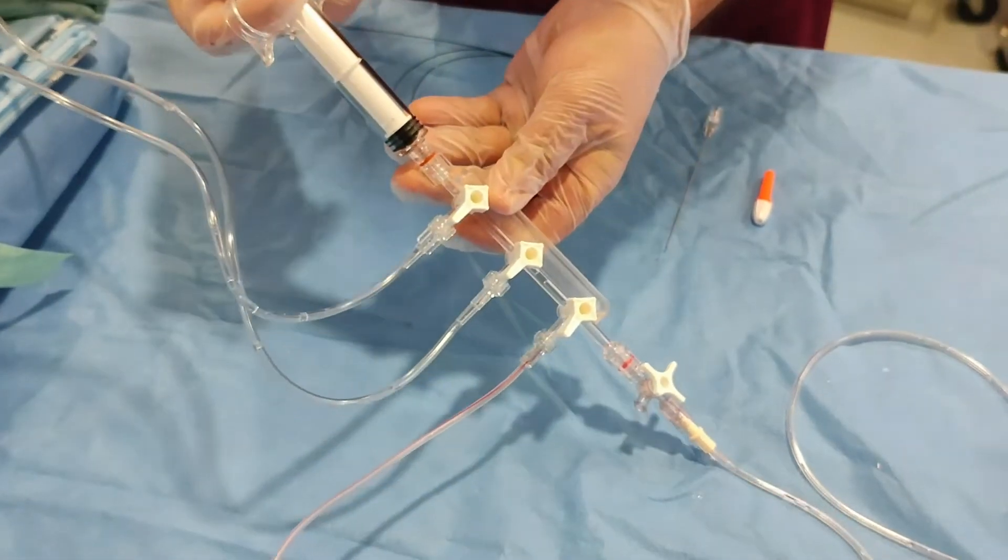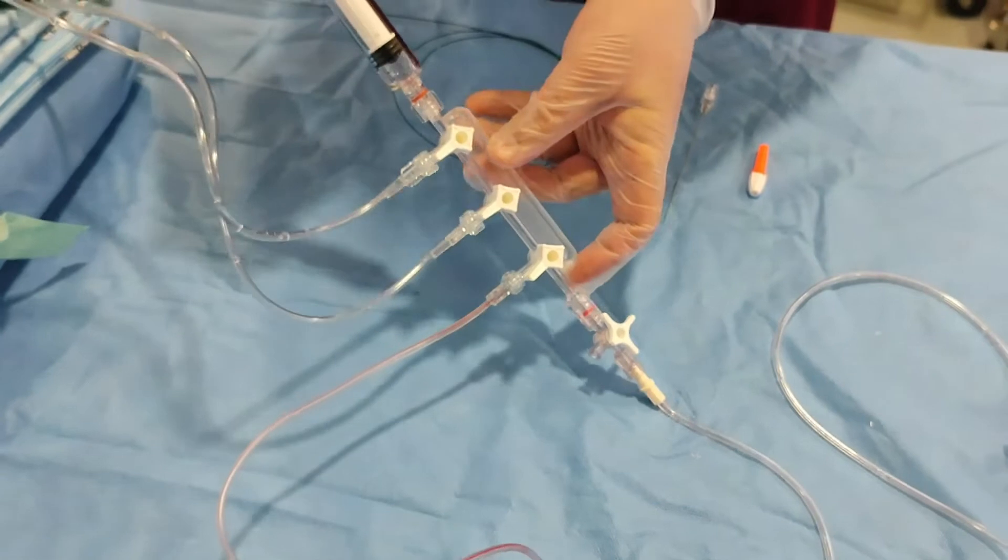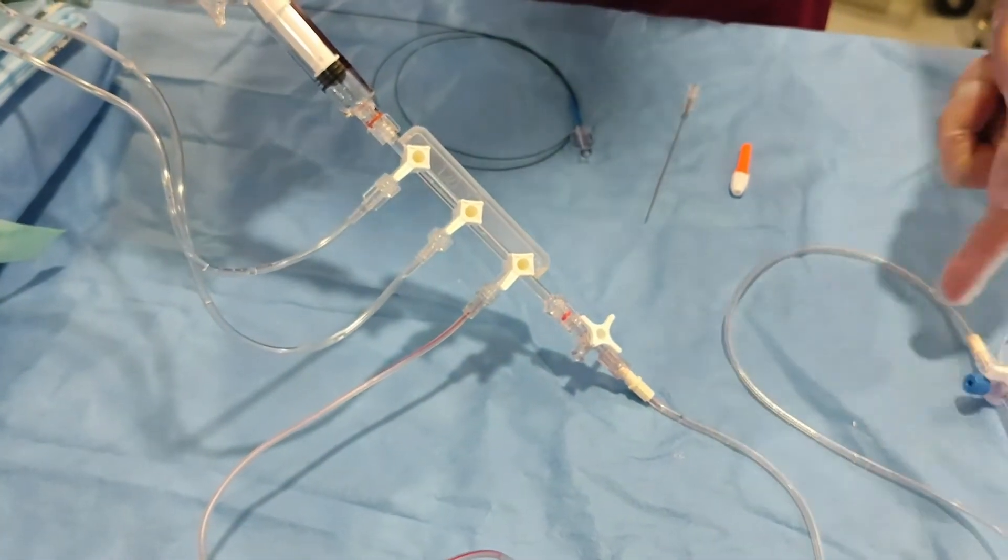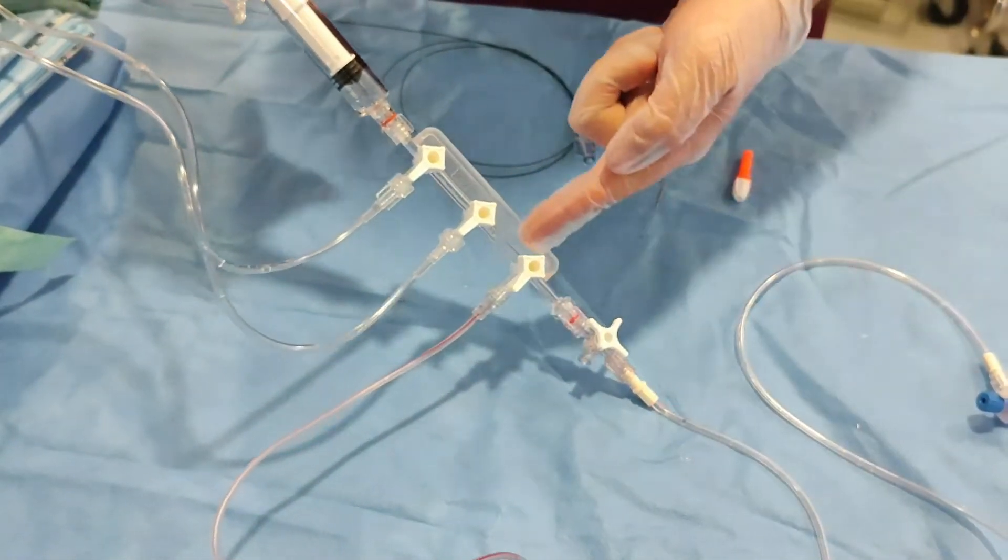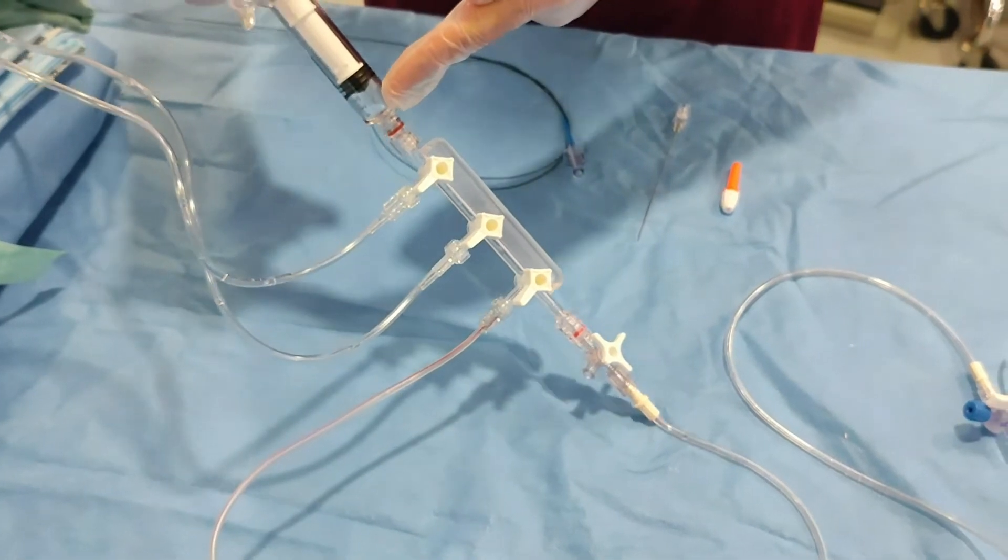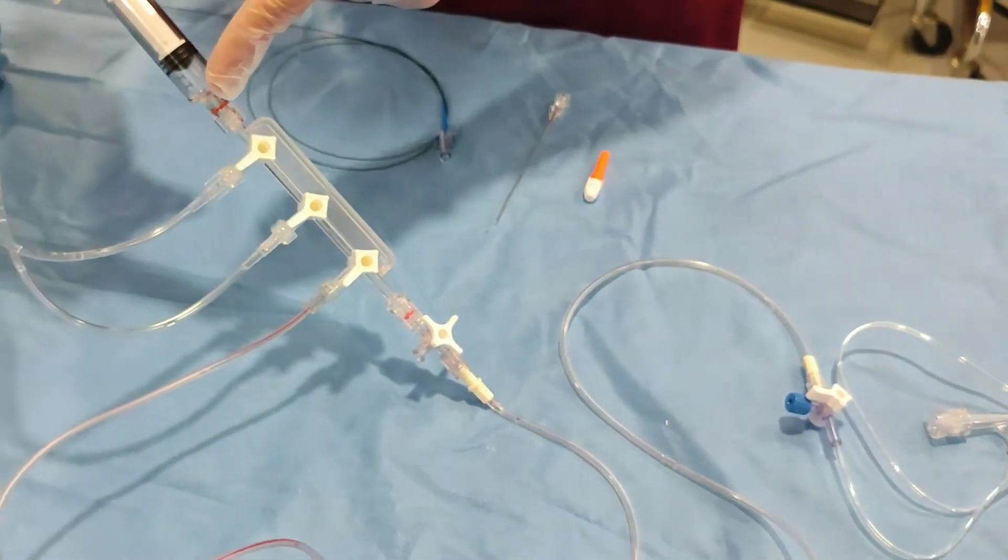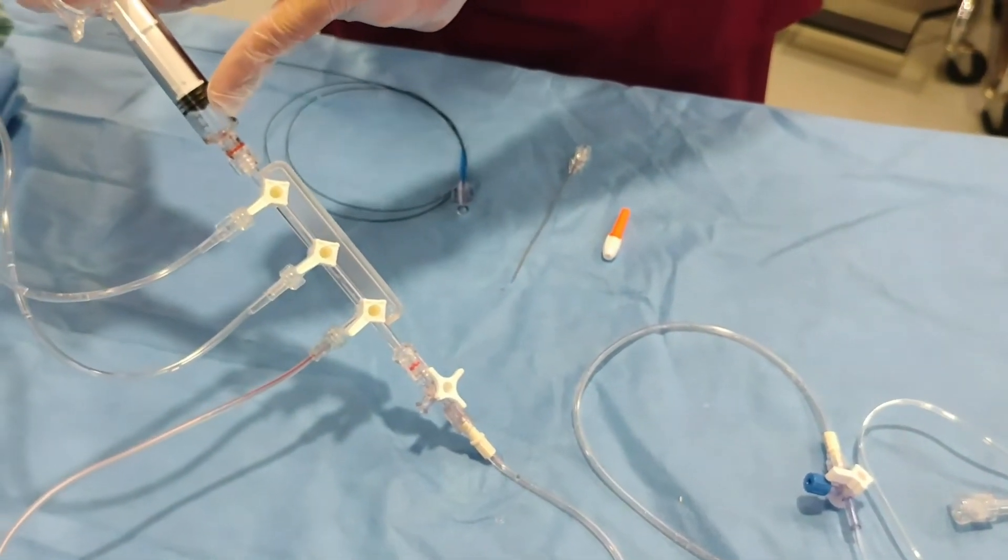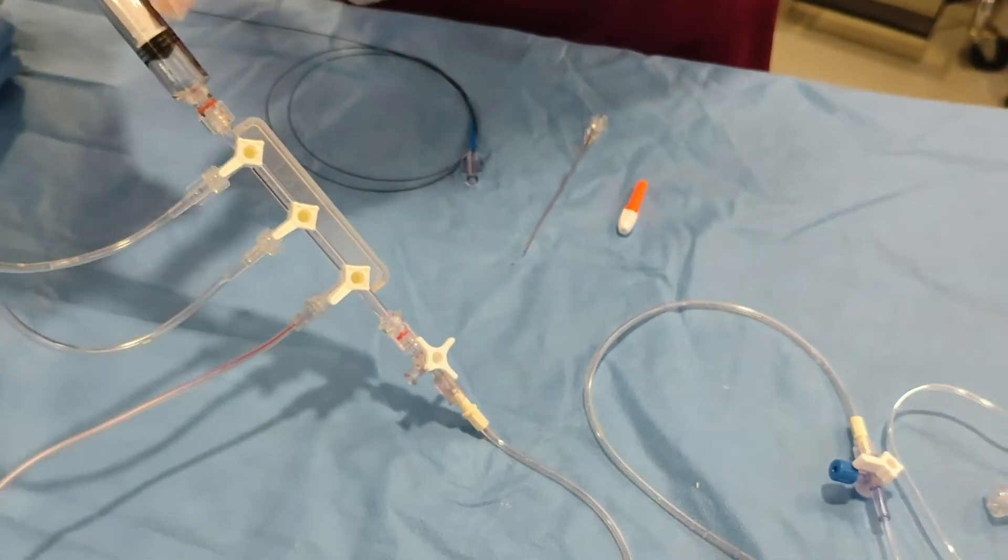After this, once you connect it, the operator should open it towards the operator side and need to aspirate. Aspiration is most important to take the blood out. You will see the blood coming out here. Why is that so? Just to avoid the air bubbles.